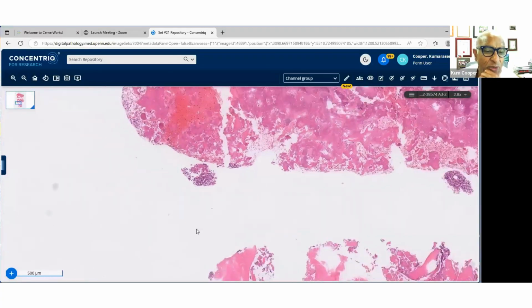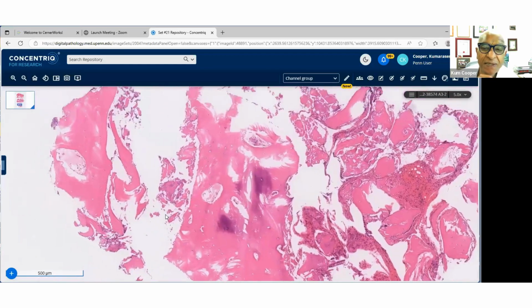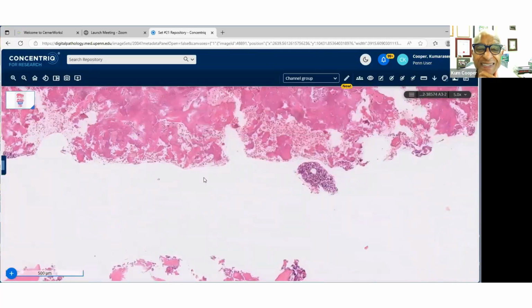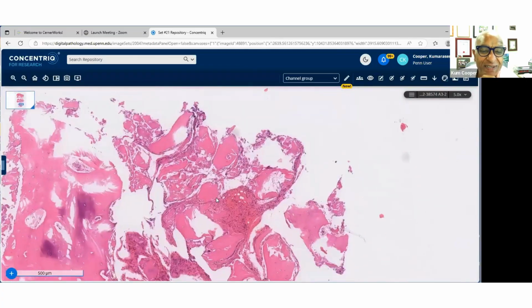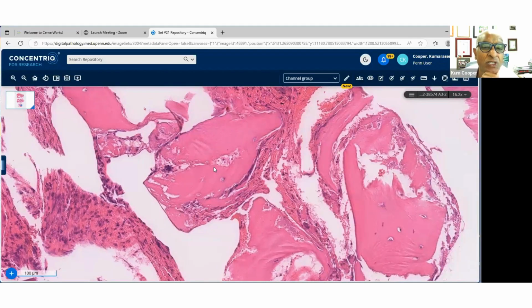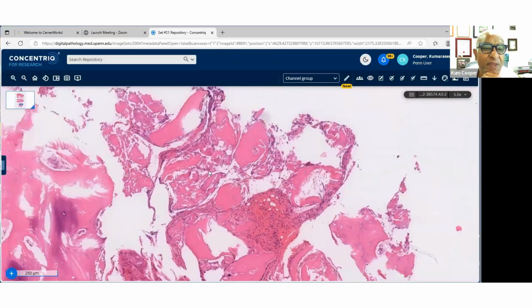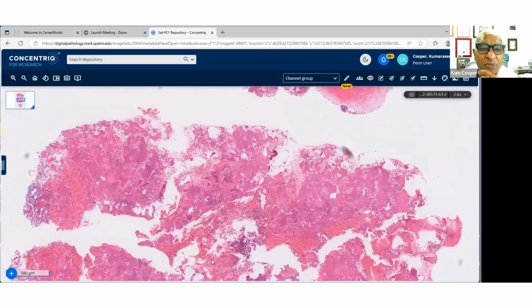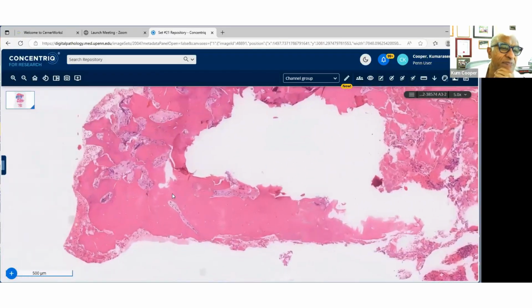Yeah, this is much more of the cortical bone, looking much more dense here. I thought I saw osteoblasts, but they're not showing any rimming there. Any thoughts? Typically I ask the question, particularly with bones, what do you want?